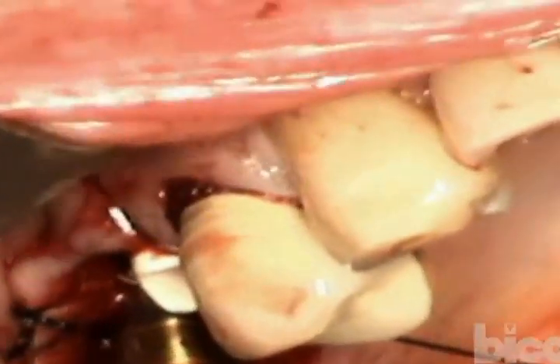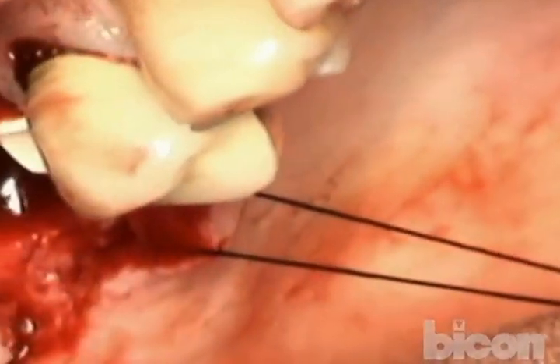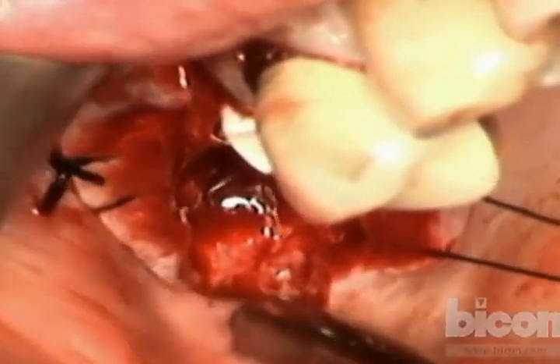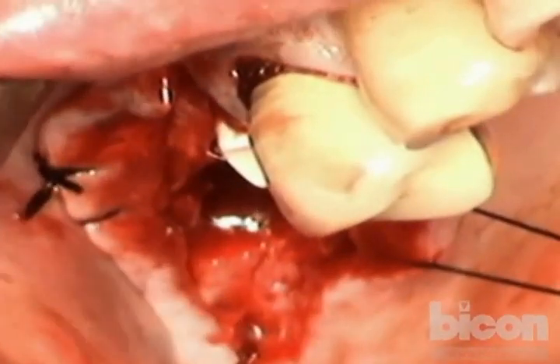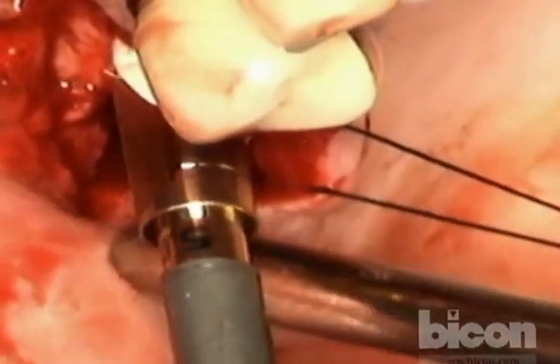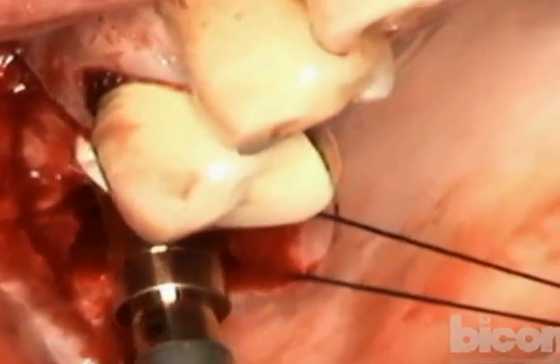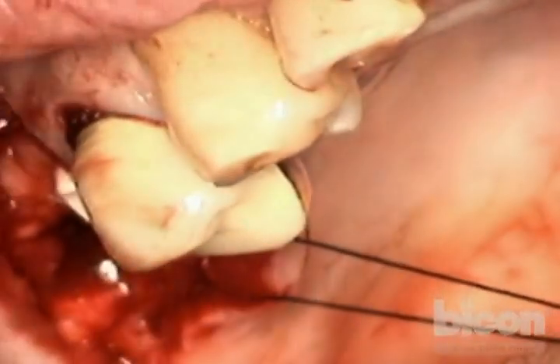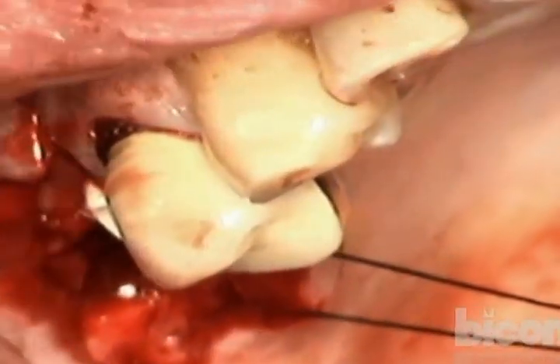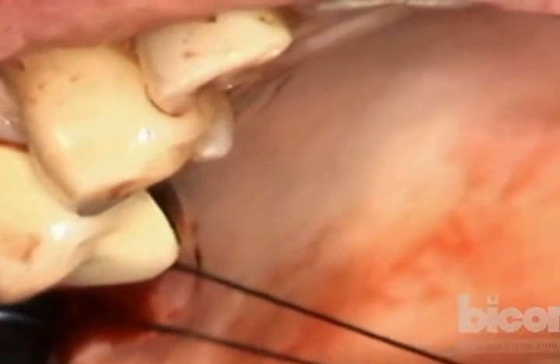I'm going to go to 5 millimeter by 6 millimeter in the mesial or in the bicuspid. It's a little bit too tight for my liking, so I will use the hand reamer as well and loosen it a little bit. The posterior one will go to 6, and that will also be done with expanders and hand reamers. I'll shave maybe a fraction of a millimeter here, but enough to give me a little bit more freedom of movement. And the same here. We'll go to 5.5 millimeter hand reamer for the molar implant. Well, the second molar implant.